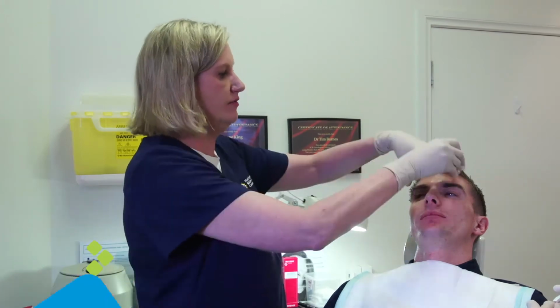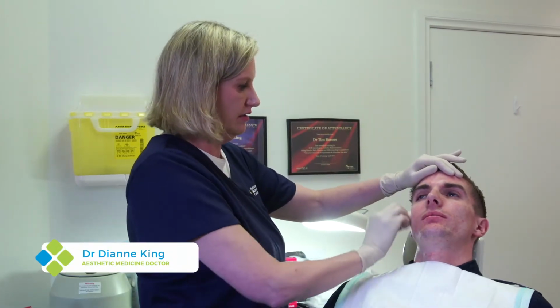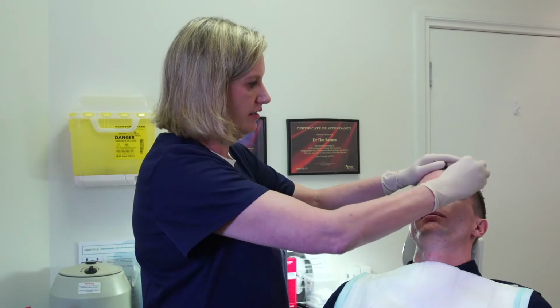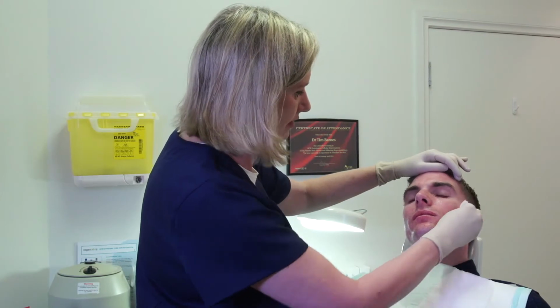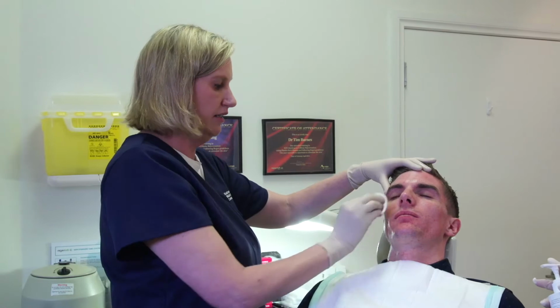Okay, so we'll just wipe your numbing cream off, Josh. So with Josh, we're addressing acne scarring on the face. He had acne as a kid. Did you have anything special for it? Not really, no. Just mild acne that settled down, but everyone ends up with a bit of scarring after acne.